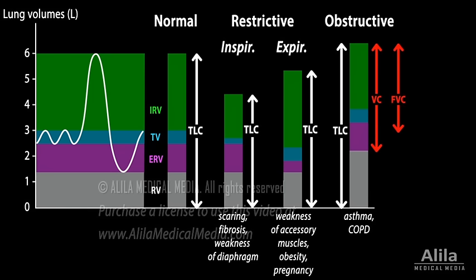A more reliable indicator of obstructive lung disease, however, is the lower percentage of air that is exhaled during the first second of forceful exhalation.